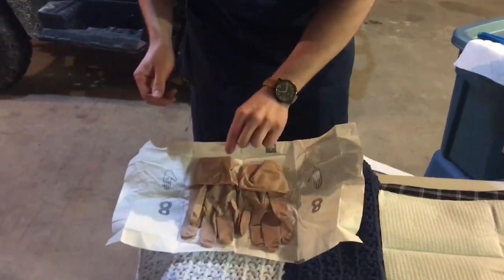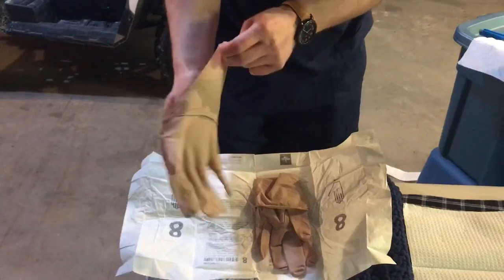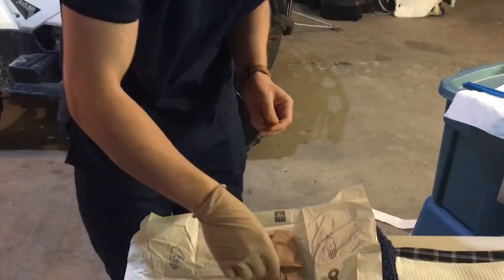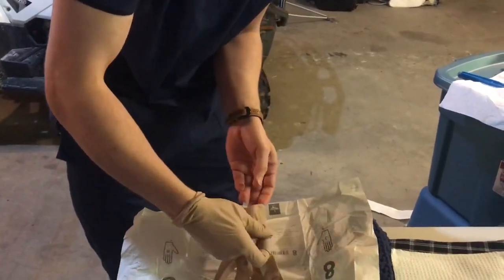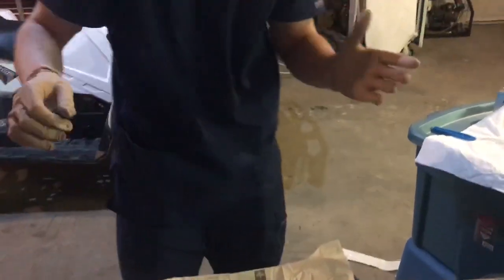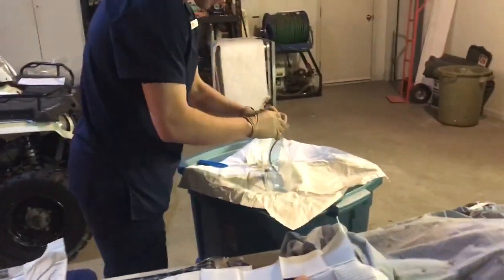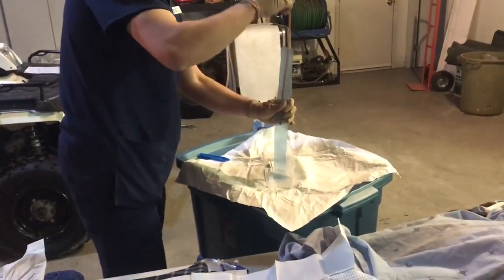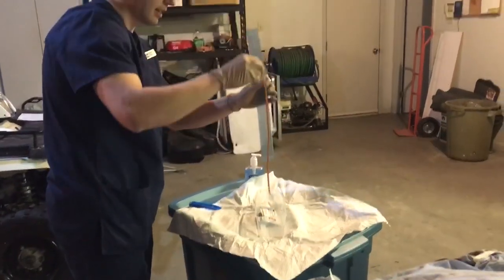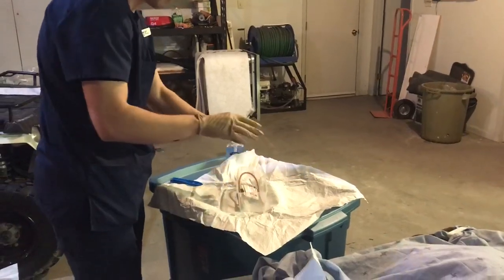So I'm going to start with the right hand first, and then the left hand, like that, and I can leave that like that. Then I'm going to go to my boat and pull out my Foley catheter from the bag, and I'm going to throw that in the garbage, keeping my hands at above waist level.